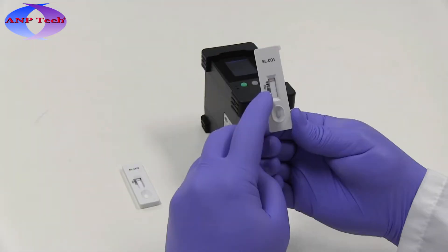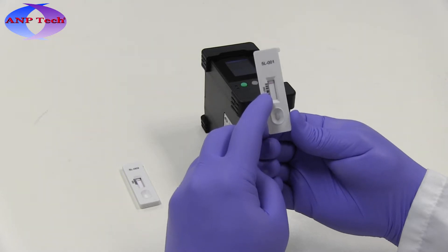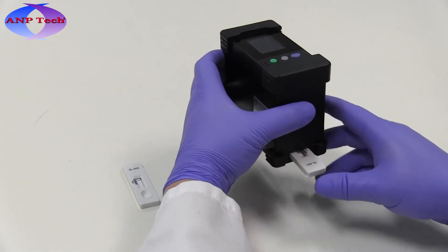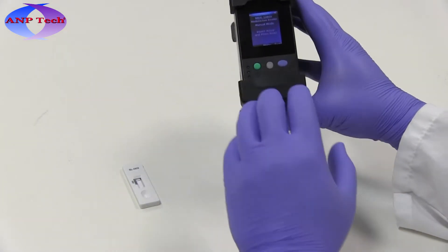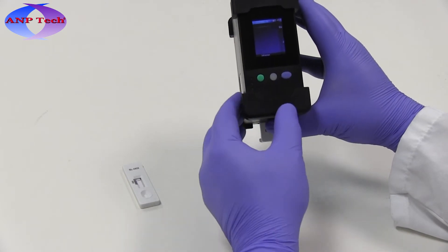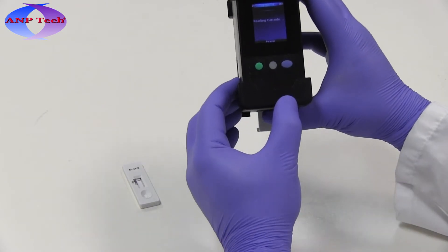The reader will identify the assay based on its product barcode. If no barcode is available, the user will be presented with a list of potential assays to select from. Insert a developed assay, sample well first, into the reader, making sure to insert it all the way for proper use.